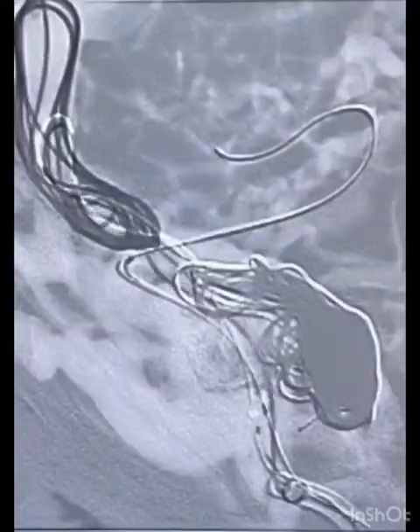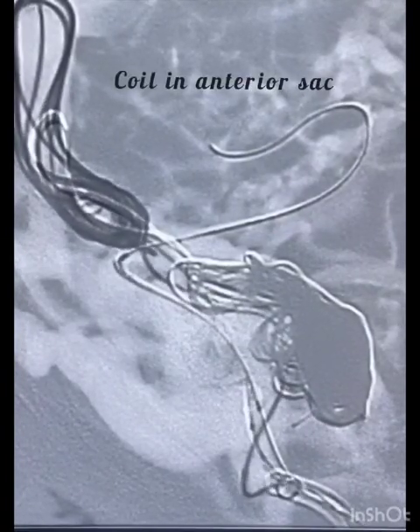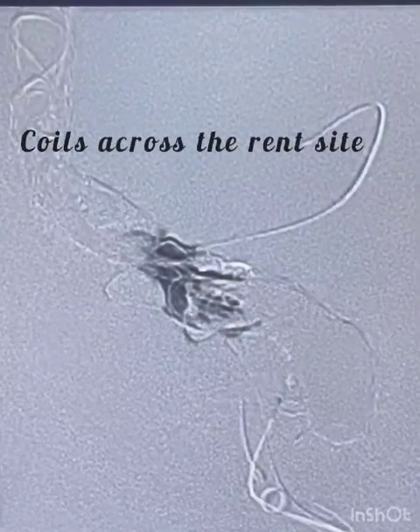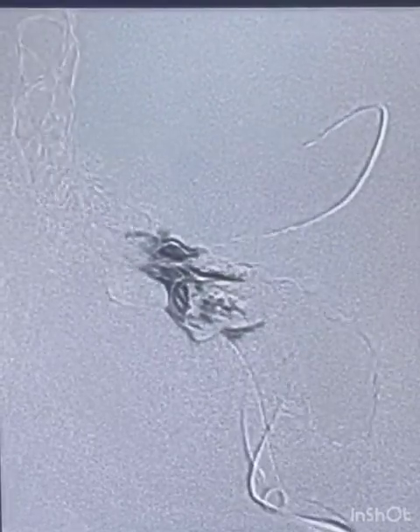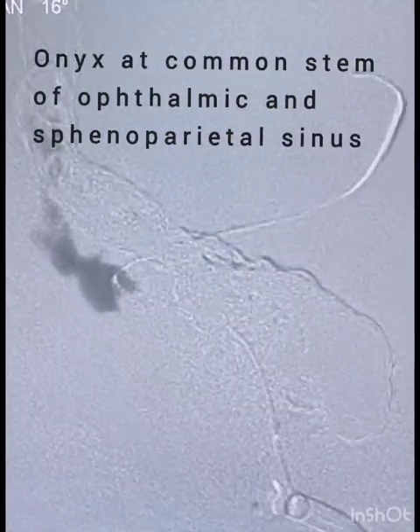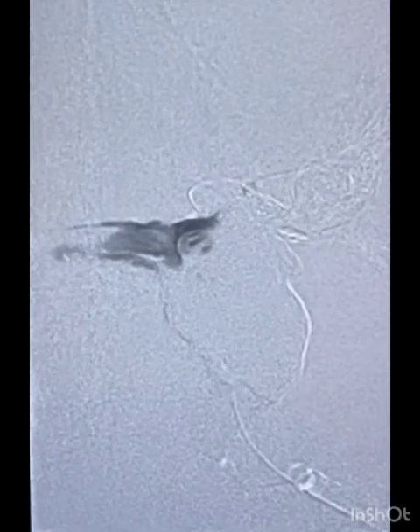Thereafter, two microcatheters were placed into the anterior sac and progressively coils were deployed in the anterior sac as well as across the rent, as noticed on the roadmap here. Onyx was injected from the anterior microcatheter, which showed spread of Onyx into the ophthalmic vein. Thereafter, Onyx was injected from the microcatheter that was across the rent site with balloon inflation.